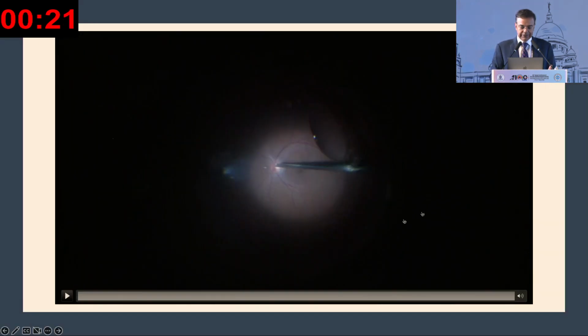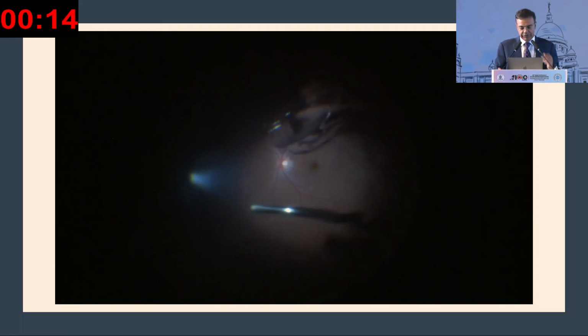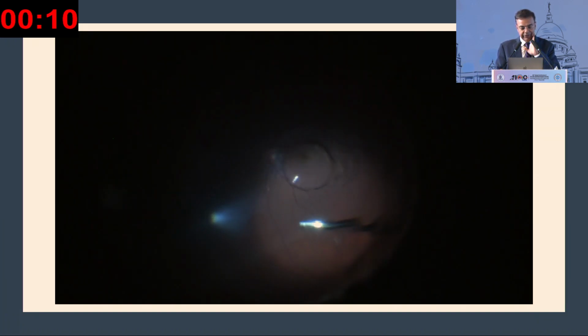And now the last video that I thought I'll share with you if I still have time. This is something which was referred to us by one of the colleagues. He had a dislocated multifocal IOL of some kind. I think it's a Rayner multifocal of the older design sitting on the retina.